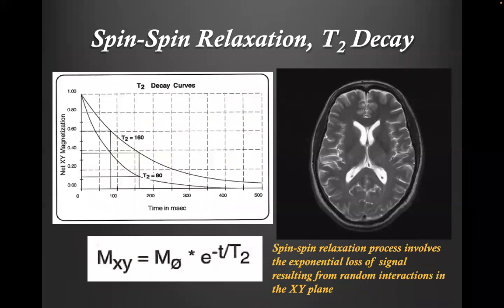There's another thing called T2 weighted sequences. So T2 time is characterizing these spin-spin interactions after the spins are getting excited. So it's a different relaxation or decay, so-called, because it starts from a strong signal and goes to 0 after excitation. And again, different tissue types will have different T2 values. And here you can see, like gray and white matter having similar T2 property, but you can see the CSF is extremely bright, which means that T2 of the CSF is actually drastically different than your gray and white matter tissues.